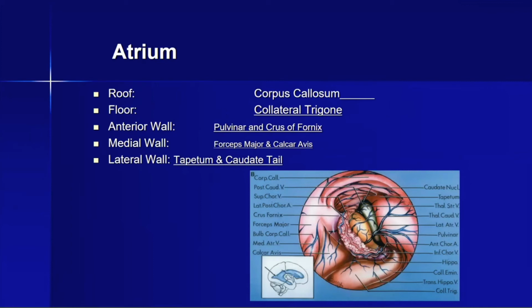So that's why it's really important. These days we usually have an endoscope, so we know usually where we are going. We often have stealth, so your anatomical landmarks are verified not just by your experience, but with the help of neuronavigation.